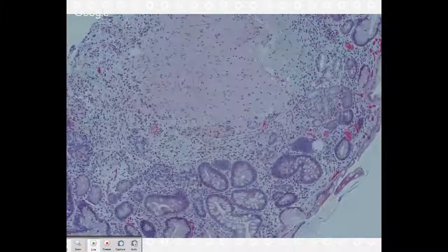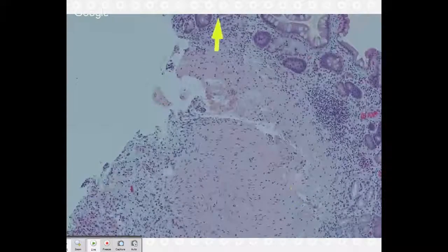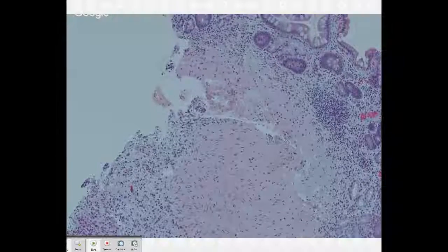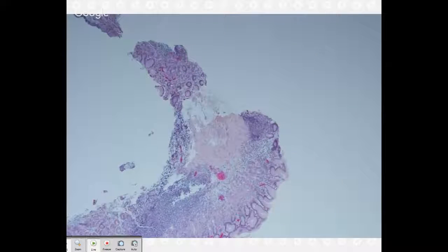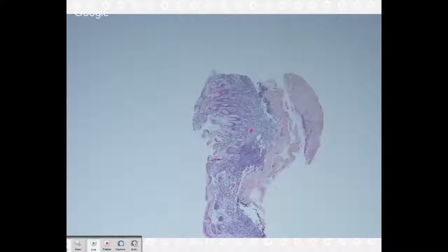There is probably some atrophy of the glands at some places. And you say that because we've definitely got areas that just don't have gastric pits at all. Our epithelium is just missing. I was looking for intraepithelial lymphocytosis, which is not there, so lymphocytic gastritis will be out. I was also looking for lymphoepithelial lesions, which were suspicious at some places, but I would ignore it.